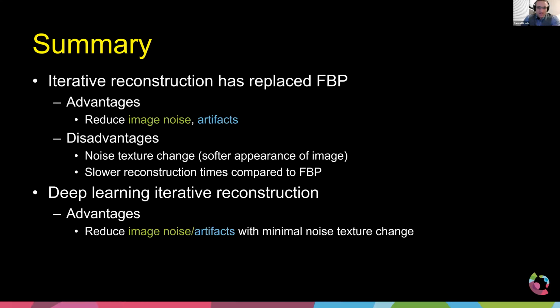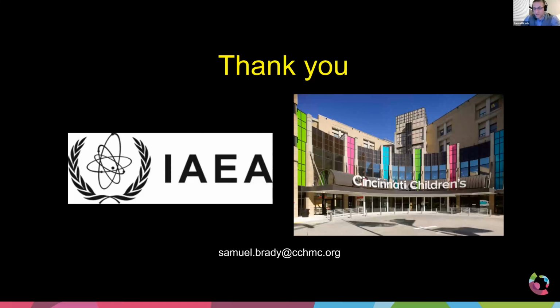And then, like I said, deep learning iterative reconstruction advantages. They once again also improve the image noise and artifacts even more so than iterative reconstruction. And we haven't really found any true impact on the diagnostic ability, the sensitivity, but I'm sure we'll find that as we continue to go forward. All right.